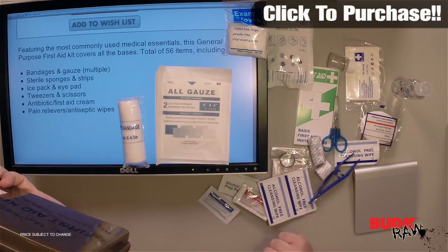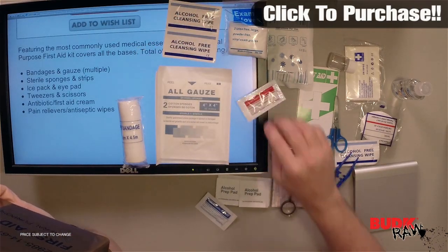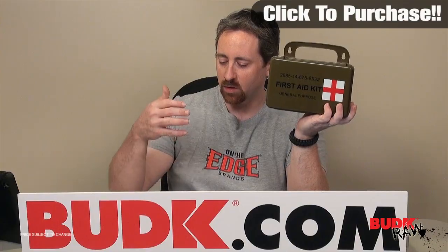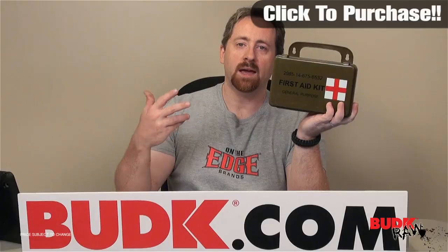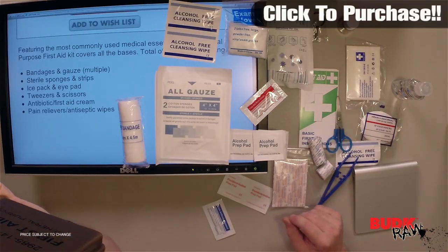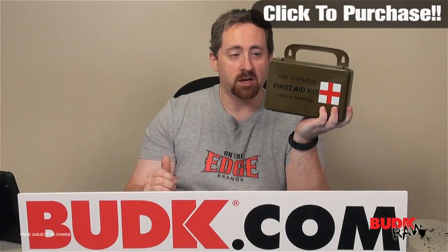If you're looking for something small and compact that can cover a number of different situations, this is designed to sustain the situation. If you need more attention, it will get you to a better location — out of the field and to a hospital if necessary. For simple cuts, sprains, and simple issues along that line, this will take care of you.